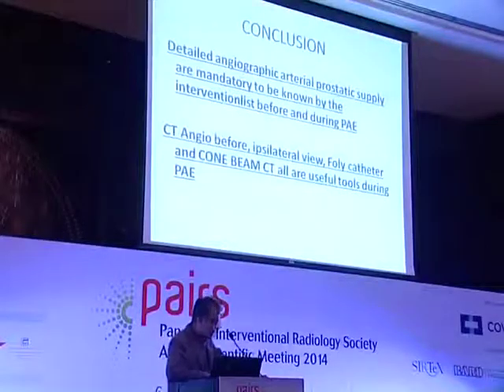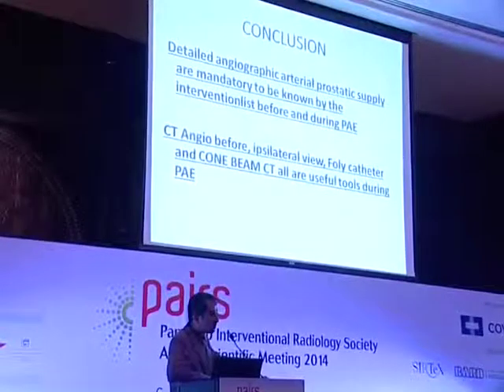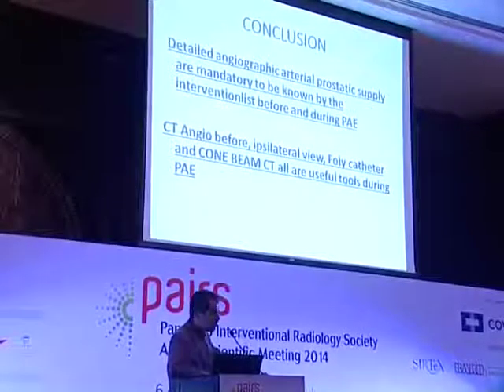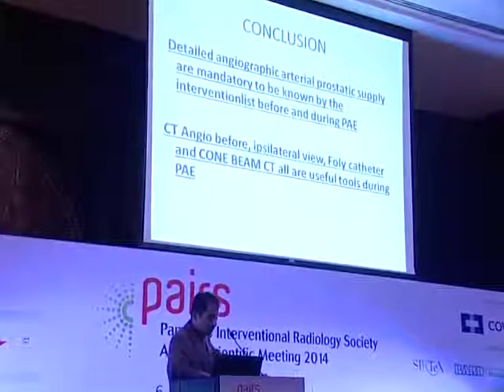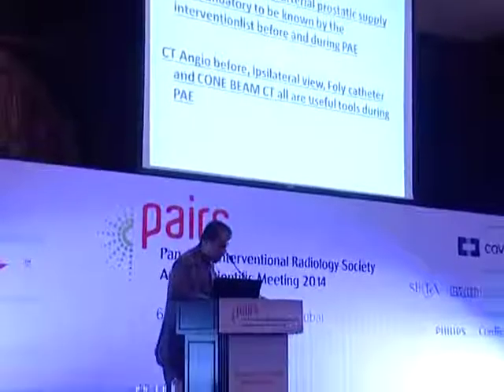So in conclusion, detailed angiographic arterial prostate supply is mandatory to be known by the interventionalist before and during PAE. I find CT angio before, ipsilateral view, Foley catheter, and cone beam CT all are useful during the prostatic artery embolization. Thank you.